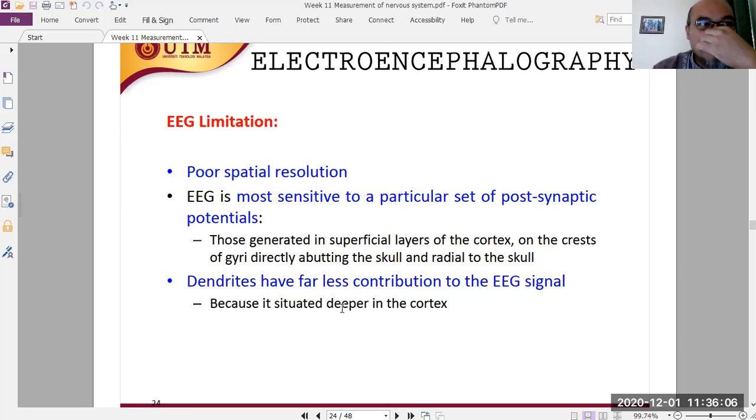For example, currently neurologists use fMRI, functional MRI, to investigate the deep part of the brain. Similar to how an MRI enhancing agent is injected, like angiography. But this is for MRI, magnetic resonance imaging, and then they can see the particles inside the brain using three-dimensional reconstruction.